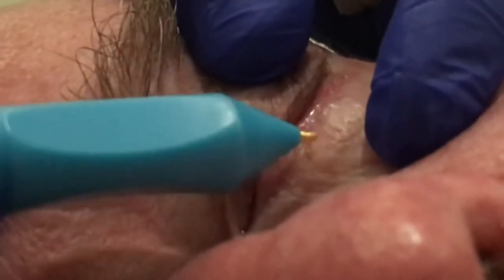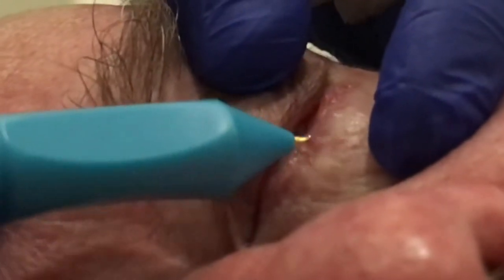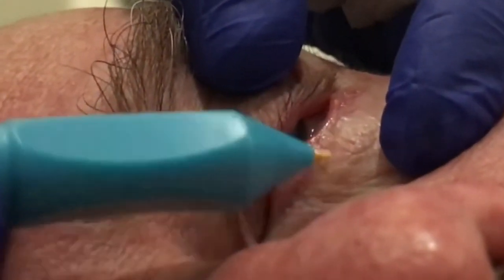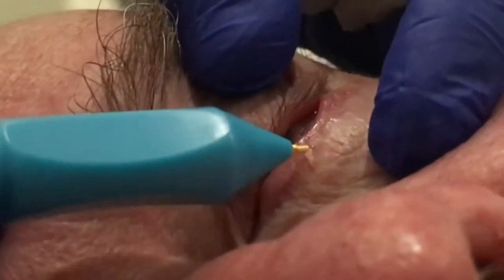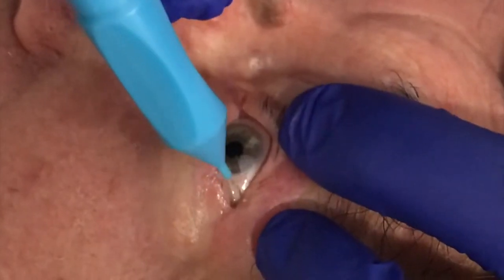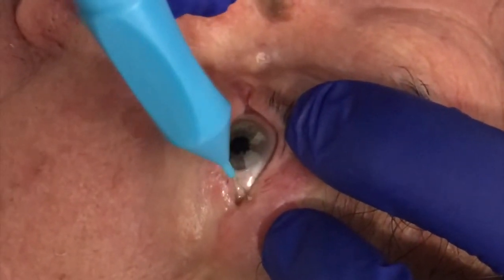Tissue bubbling does not mean that the germinal cells have all been destroyed and the follicle has been ablated, as this may take a minute or so to achieve. If tissue bubbling is minimal, move the battery's power switch to high. Rotate the needle around the hair so that all of the follicle germinal cells are reached and treated.